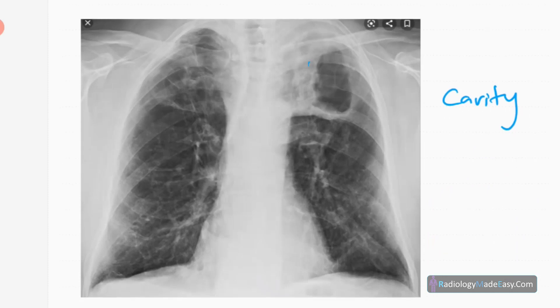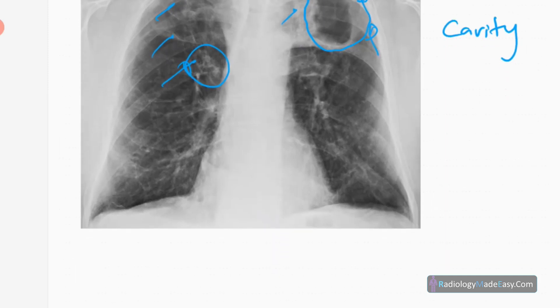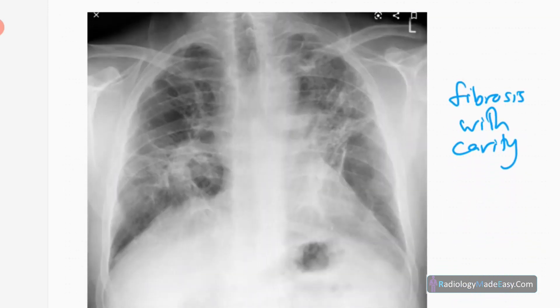The next image is about post-primary TB — cavity formation. You can see a cavity in the left upper lobe with fibrotic changes indicating volume loss. There is a cavity with peripheral consolidation suggesting active TB on top of the cavity formation. Fibrotic changes and traction bronchiectasis with dilated bronchi are visible. No effusions.